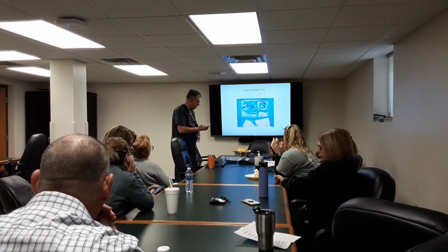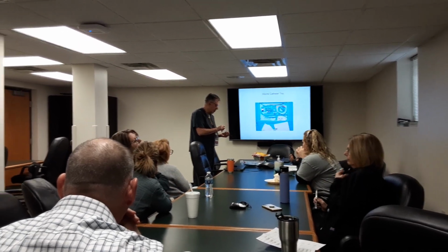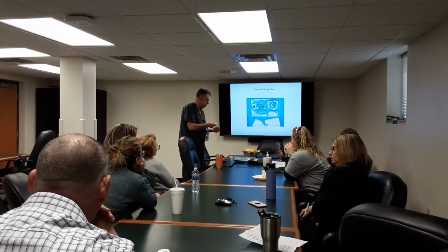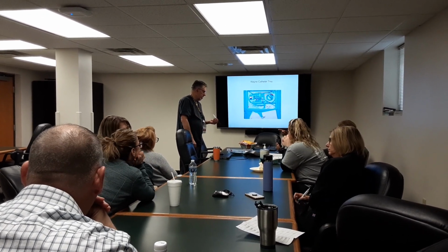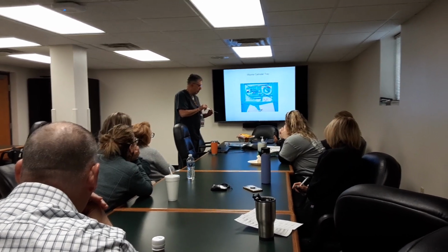And, you know, line it up with a bevel again, and you're going in with that. And at least once I'm going deep, I start out with about 3 cc's. I want to deliver at least a couple of anyway. And then how deep we go with that needle? With this needle, that's what you're doing. You're crawling over the rib, right?